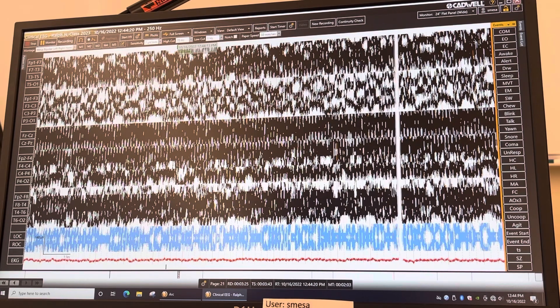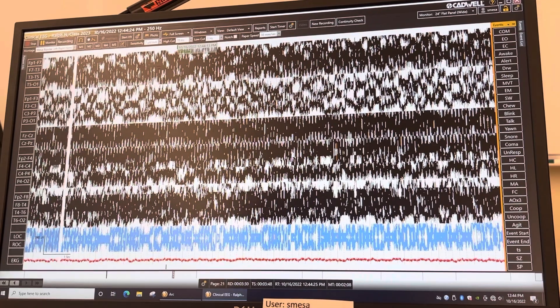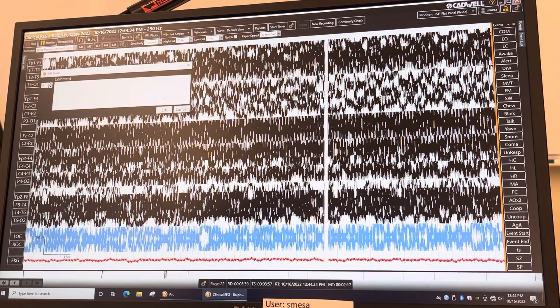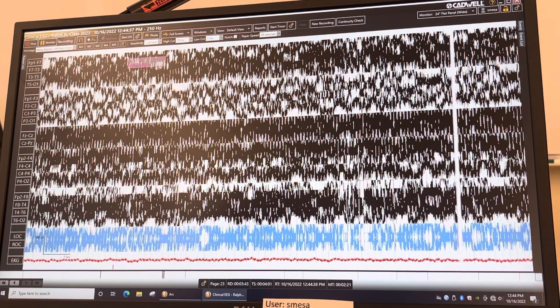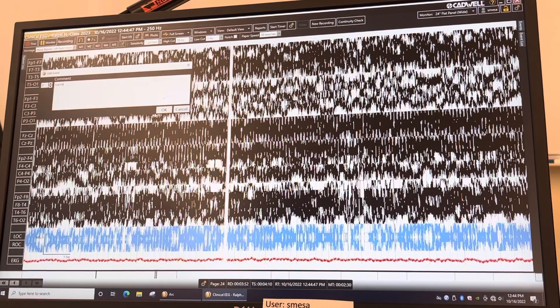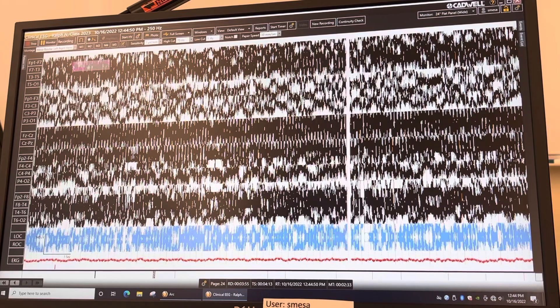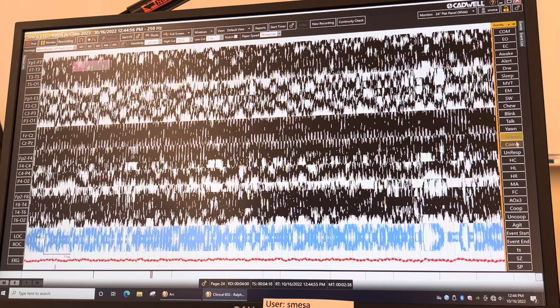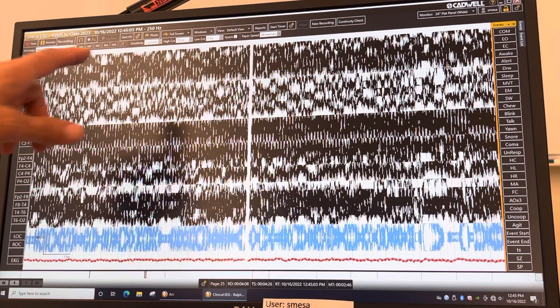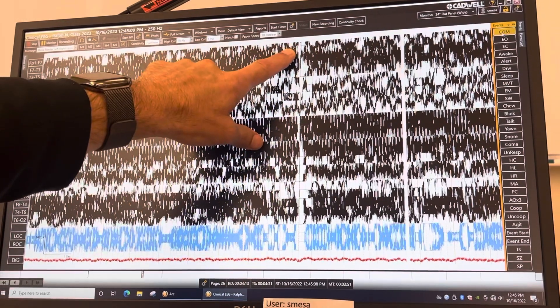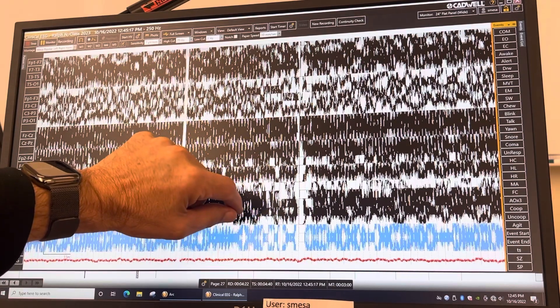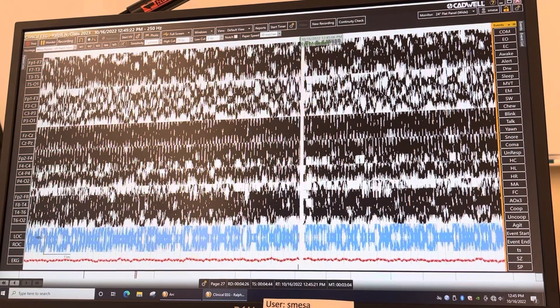You can also just start typing directly on the screen, like on the Natus or Neon Code — just type 'eyes closed' or 'supine.' Wherever you first start typing is where it will appear when you hit okay. So your two options for annotations are: click the events panel and choose one, or just start typing on the screen. To pinpoint an exact spot, click 'Eye Movement' and place it precisely where you need it.